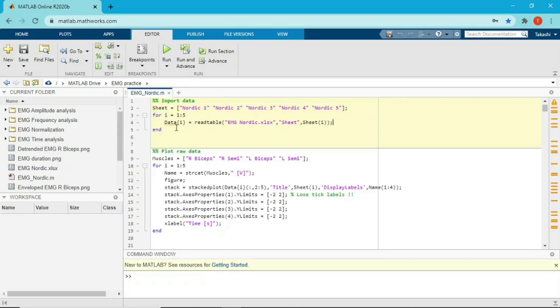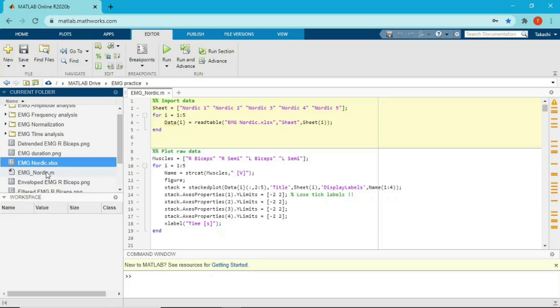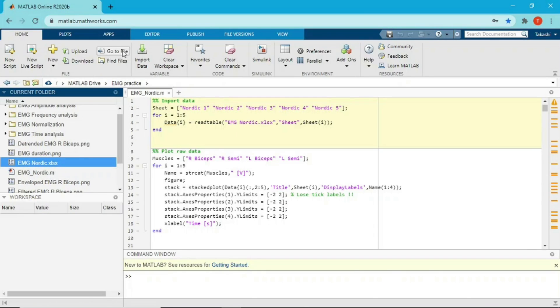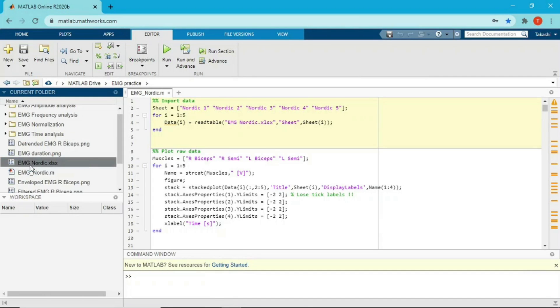Let's start. I'm going to start from the import data section, which is right here. This is the code to import data. First of all, I'm going to create a variable which contains the name of the sheet. The MATLAB code and the EMG data are on my blog, so you can download it and open it in your computer. If you have MATLAB and the data, you can drag and drop the Excel file and MATLAB code, or go to Home, click Import Data, and import the Excel file.